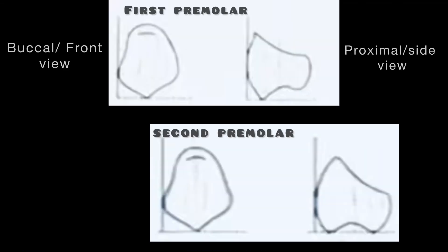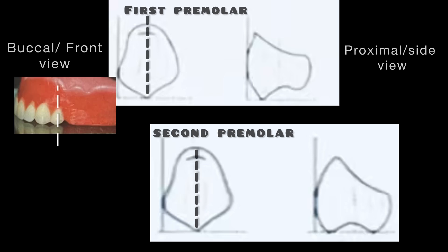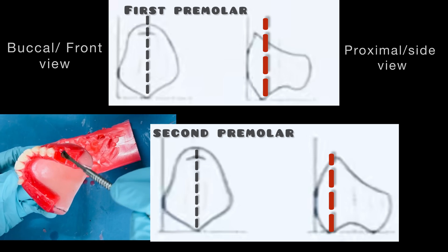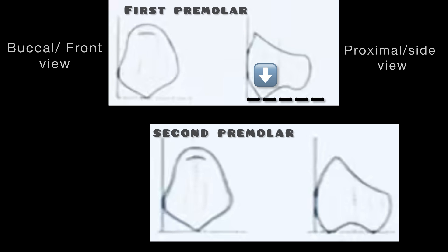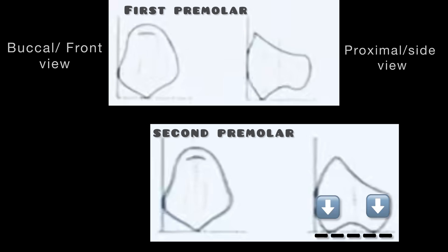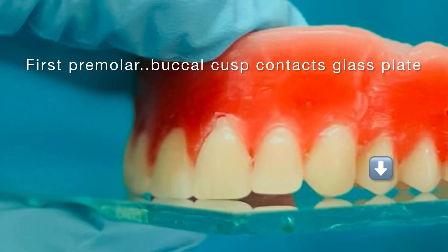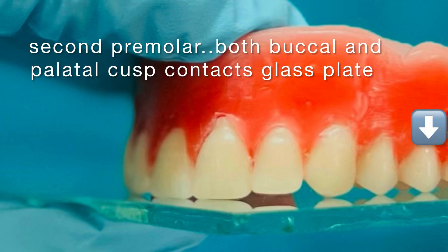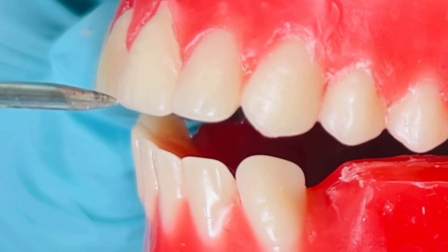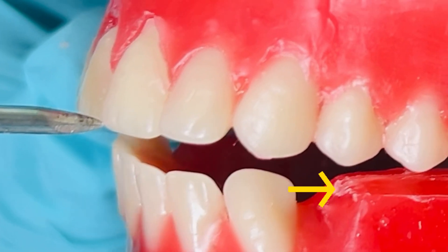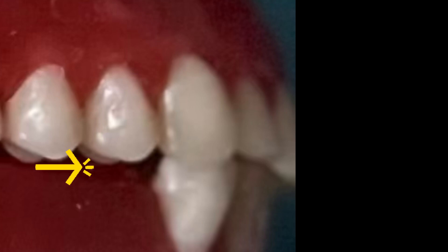Let's see the guidelines for arranging maxillary first and second premolars. Both maxillary first and second premolars are set in such a way that the long axis of these teeth are straight when viewed from the front as well as the side. But do note the difference in occlusal plane or glass plate relation. Only the buccal cusp of the maxillary first premolar touches the glass plate, whereas both the buccal as well as palatal cusp of the second premolar are in contact with the glass plate. Gently close the articulator and make sure that the palatal cusp of the premolar coincides with the reference lines drawn on the lower occlusal rim. This will ensure that we are setting the teeth on the center of the ridge.